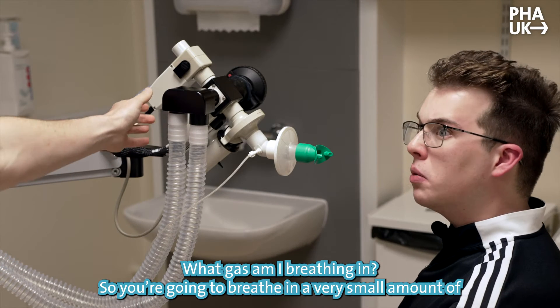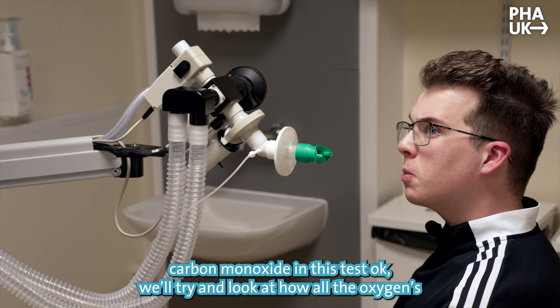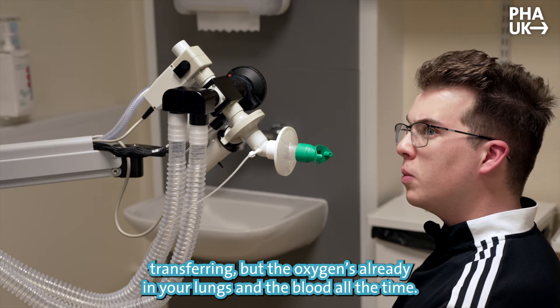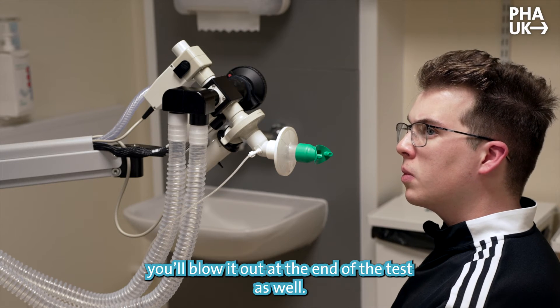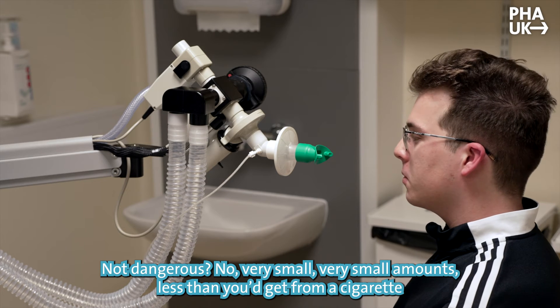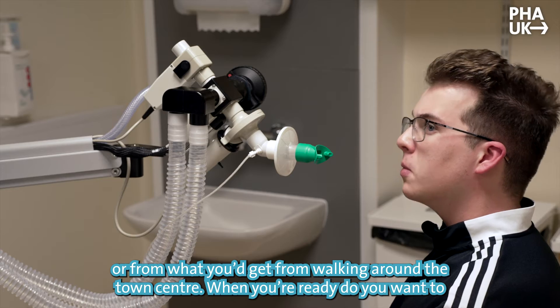What kind of stuff am I breathing in? So you're going to breathe in a very small amount of carbon monoxide in this test. We're trying to look at how well the oxygen is transferring, but since oxygen is already in your lungs and blood all the time, you get a very small amount of carbon monoxide into your lungs and you'll blow that out at the end of the test as well. Not that dangerous? No, very small amounts — it's less than you get from a cigarette or from walking around the town centre.